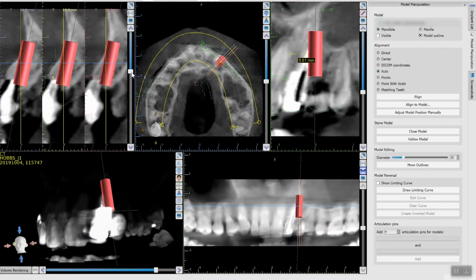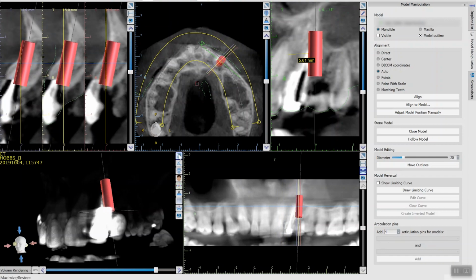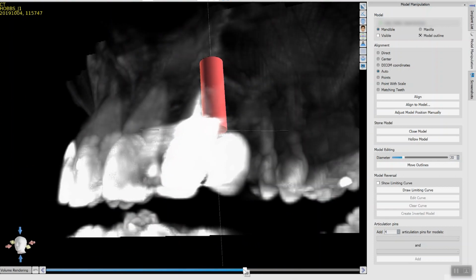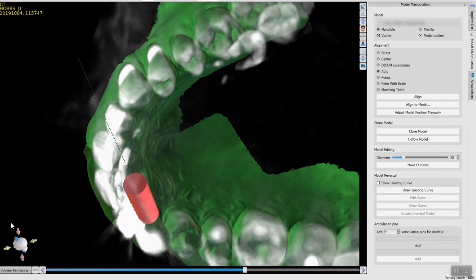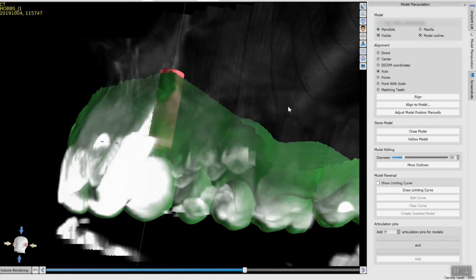The first thing I would get for any implant case is a 3D scan. We call it a CT scan, a cone beam dental CT scan, and this lets me navigate all around your bone. And I can see the thickness of the bone, I can see the distance between the roots, and I can import that scan into a specialist implant software, and I can virtually place the best implant. These implant softwares have all the implants pre-built into them, so I can virtually place and decide what the best length of implant is, what the best thickness of implant is, and the most ideal implant position. And this can all be done virtually just from a CT scan.